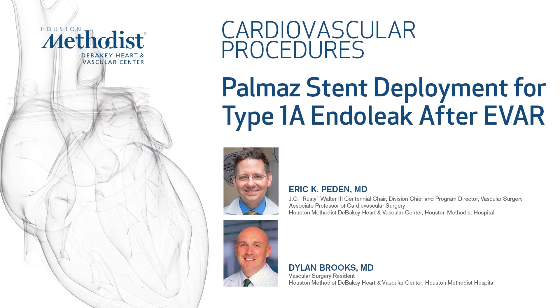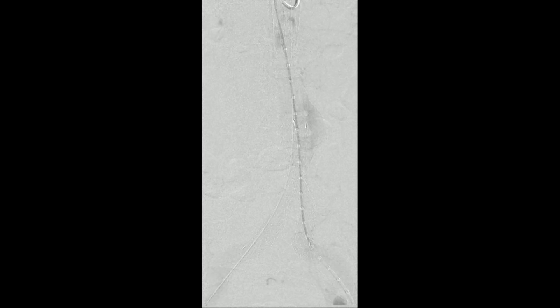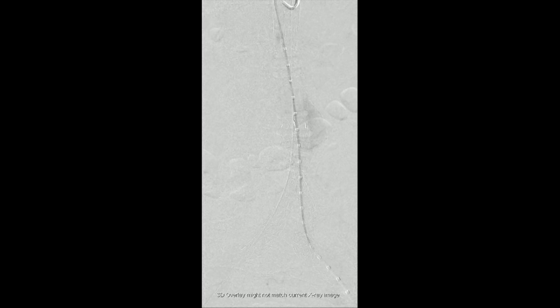This video demonstrates deployment of a giant Palmas stent for a type 1a endoleak for an abdominal aortic aneurysm status post endovascular repair.